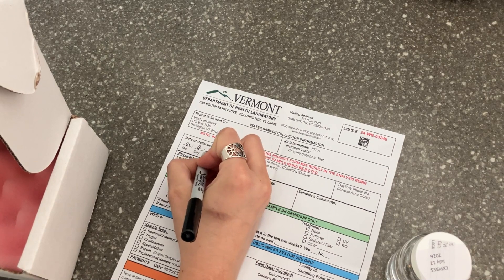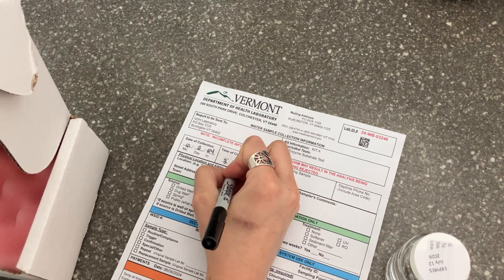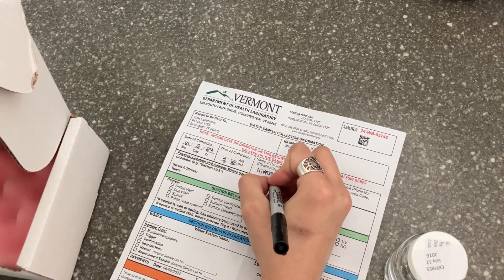For your water sample to be accepted, it's important that the water sample collection form is filled out completely. Check that your printed name and address are correct. Fill in the date and time the sample was collected.